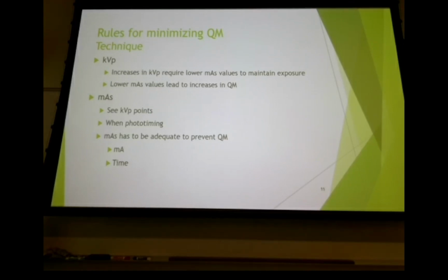Like, what do you shoot for a chest X-ray now, kVp wise? What's that? 110, 120 kVp, very high kVp, really kind of high kVp anyway. How about for a KUB? 80, 85, yeah. So think about those structures though. You've got a chest X-ray, which is primarily air, right? And then you've got the abdomen, which is solid organ system, right? So why high kVp for a chest X-ray?